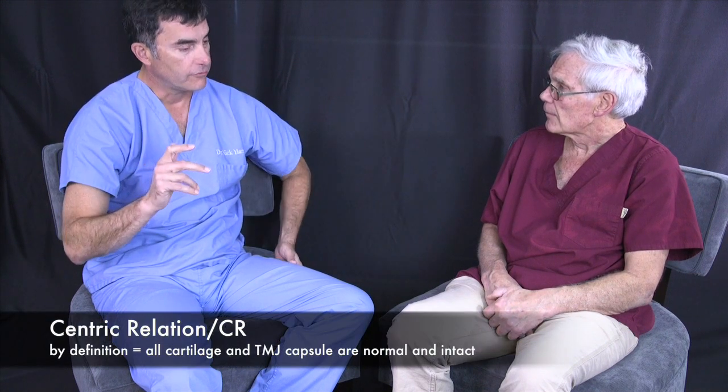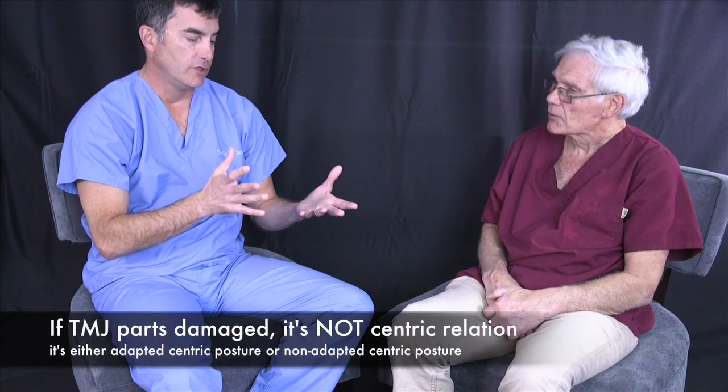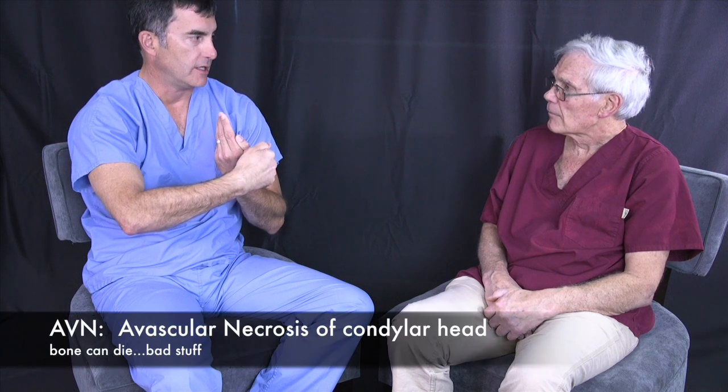Right. And if you put in a splint without looking at the back, for example, we talked about this earlier, let's say in centric relation or fully seated condylar position, or in this case it would be called truly non-adapted centric posture, by forcing that mandible back you're dragging that bone up higher, and that disc is more likely to cut off that blood supply coming in medially. That's when you can get an AVN.